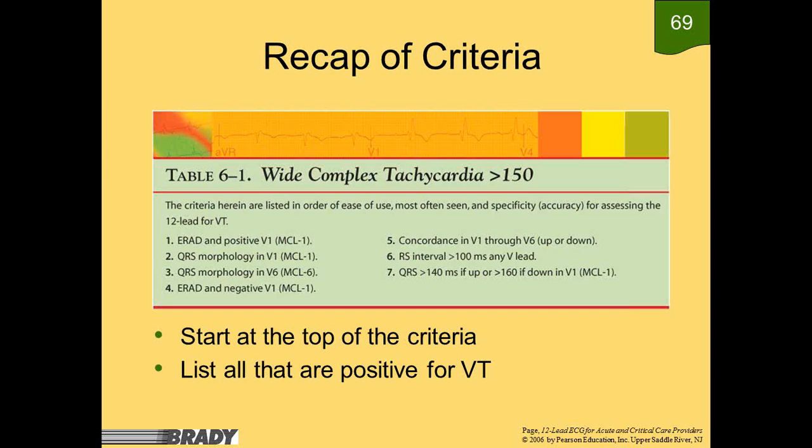If you see that regularly, we would think maybe it's right-sided heart failure. But if it's irregular, that would be that the ventricles are kind of doing their own thing. So when the atrium contracts, the ventricle's a little off beat with it. They're not talking. We have that disassociation, and so they'll be irregular. So watch for those. If you happen to see it, look and see if it matches the monitor. And if it does, then we probably have right-sided heart failure. If it doesn't, then we want to think about that disassociation.